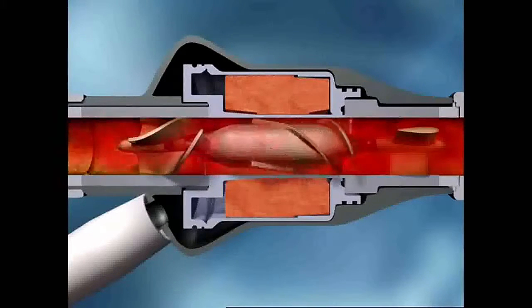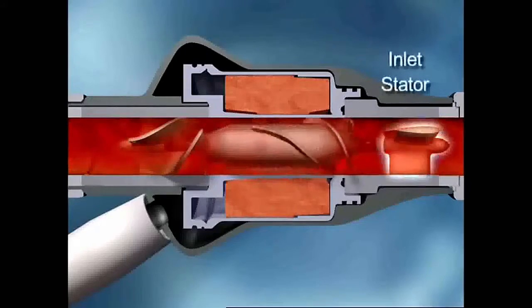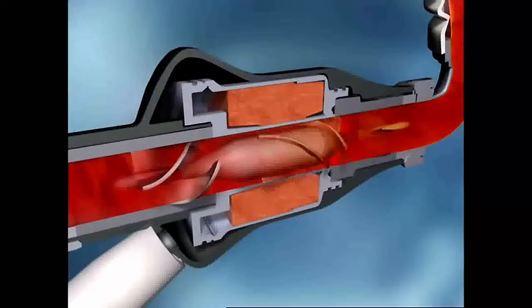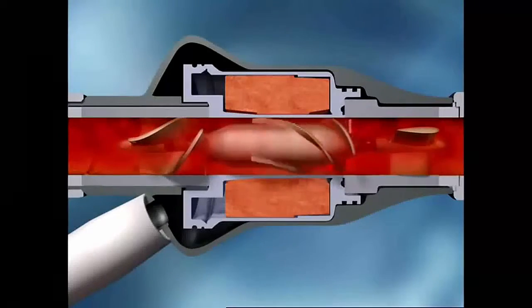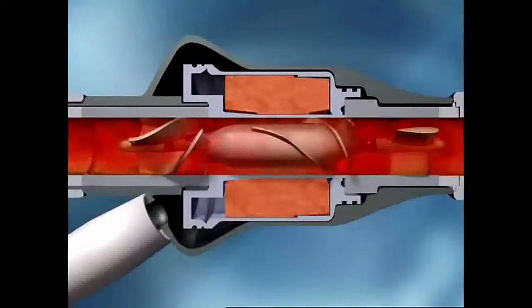As blood enters the pump, seen here in slow motion, it is straightened by the inlet stator vanes prior to entering the path of the rotor. The rotor then spins the blood radially and propels it toward the outlet, where blood flow is straightened by the outlet stator vanes. In typical operation, the pump runs from 8 to 10,000 RPM.